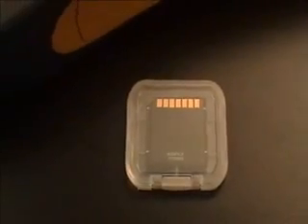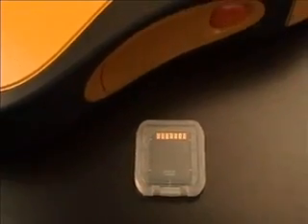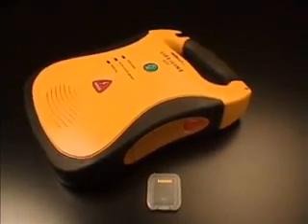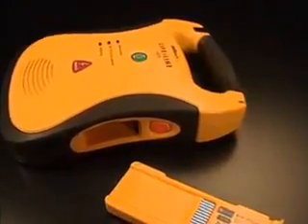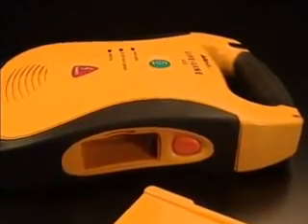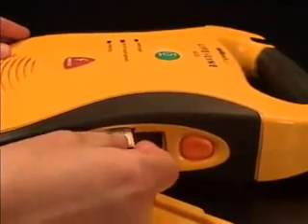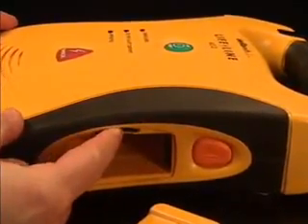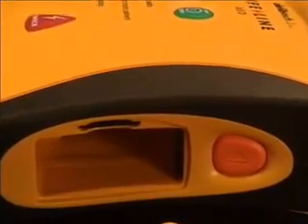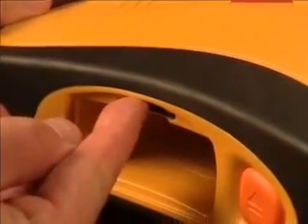The optional data card is used to store extended amounts of ECG data and, optionally, audio data for later review. Note that the Lifeline will store critical ECG data internally even if no data card is installed. To install the data card, first remove the battery pack. Install the data card in the slot located within the battery compartment. Insert the card label-side-up, angled corner end first, into the slot, and push in until it clicks into place. When properly inserted, the data card will be flush with the end of the slot. To remove the data card, push the card in until you feel it click; the card will be partially ejected and may then be removed.